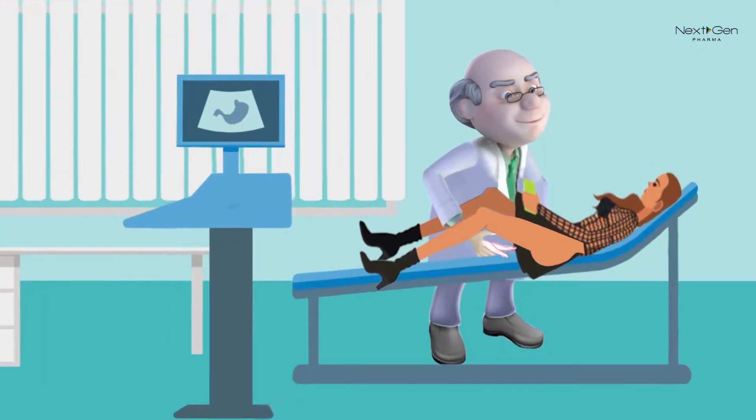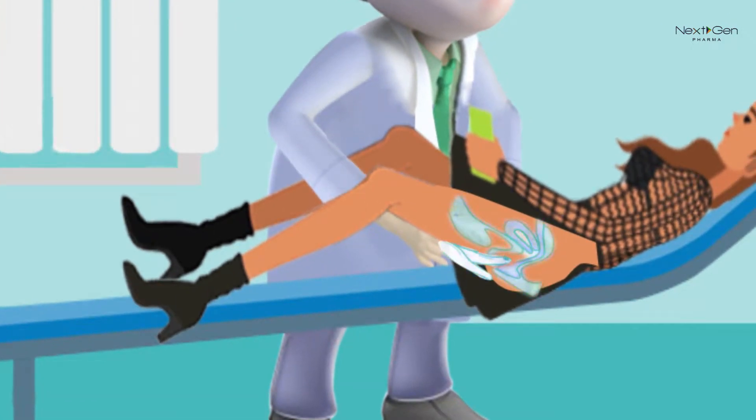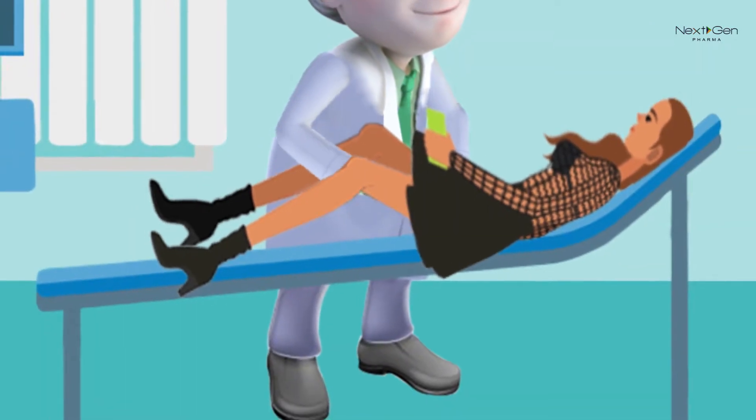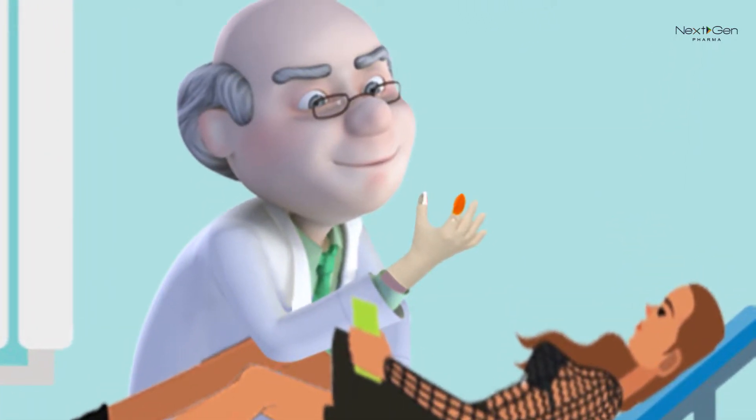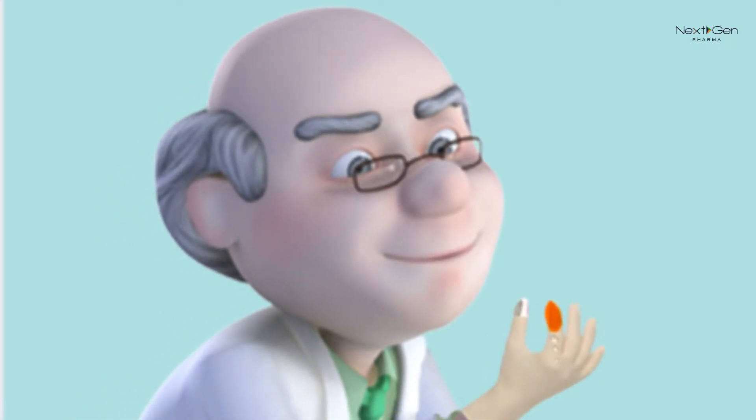Insert your forefinger in the vagina and hold for 5-10 seconds and take out. The absorbing gauze should be wet with the vaginal fluid. Immediately press together your forefinger and your thumb, making sure the absorbing pad is pressed against the pH indicator for at least 5 seconds.